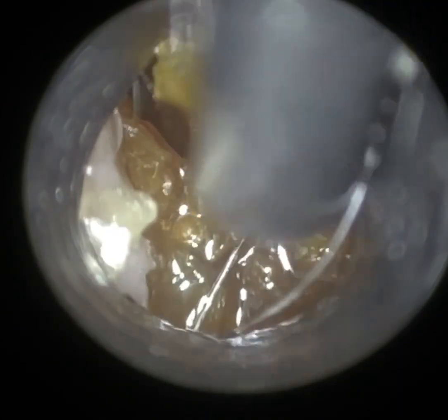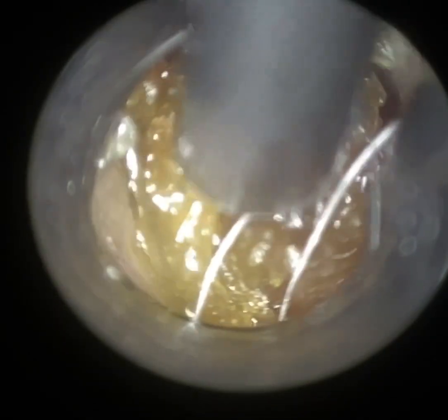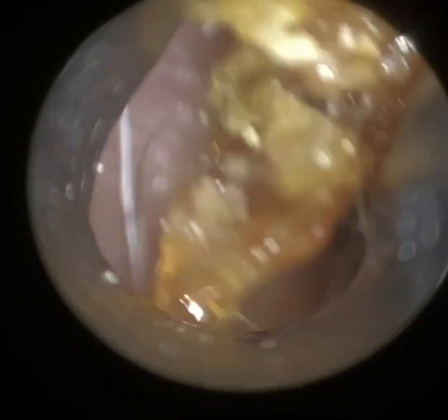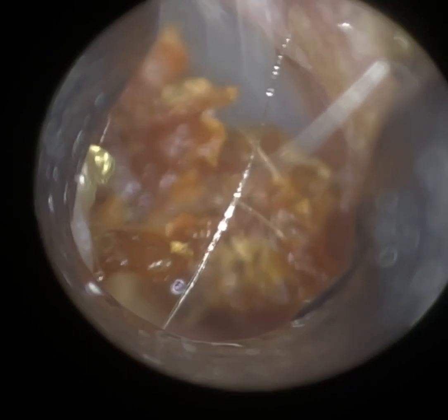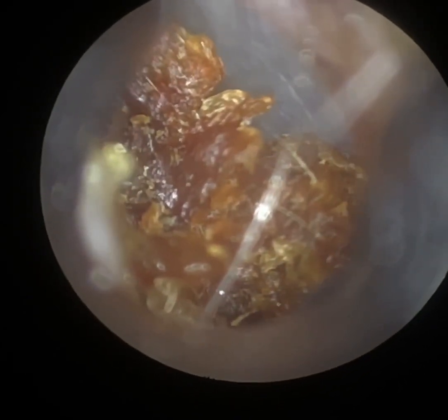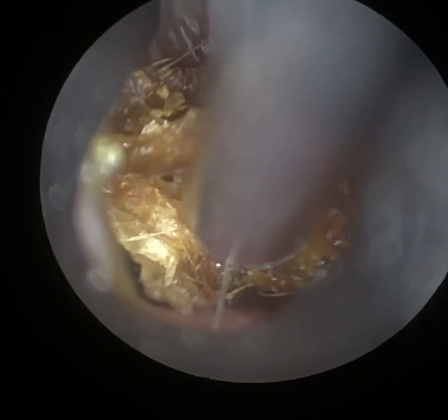It's just a piece of skin — the roof of the ear canal is going to peel that way first. So I'm using our 4.25mm speculum. There is a smaller one, 3.5mm as well, but there's no need for me to use that — even in the right ear it wouldn't have gone that deep and widened the mid-portion of that ear. So the 4.25mm is fine. With the oil, it just helps us get a better suction grip. We've got a bit of wax a bit deeper now — probably about half a centimetre away from the eardrum. You can see the eardrum in the distance, the blue tinge around 2 o'clock.